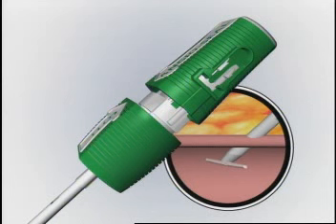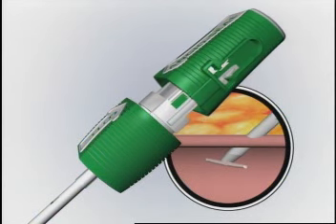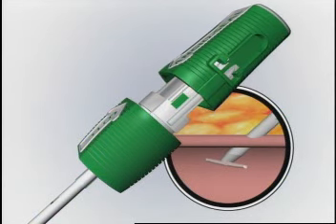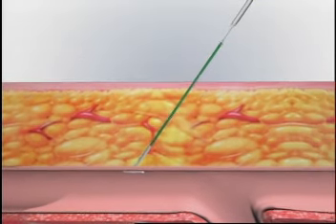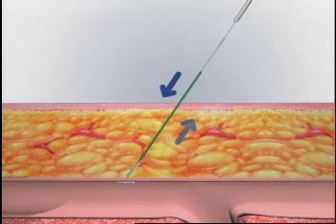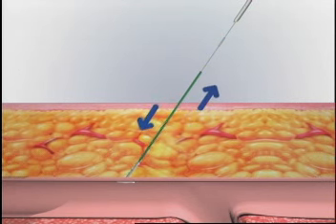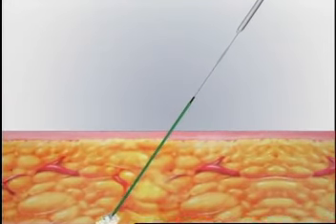You will now need to pull the device back into the final lock position. Some resistance will be felt as the device cap and sleeve lock together. The color bands on the side of the device should be fully exposed. Slowly remove the full assembly from the tissue tract until the tamper tube appears. Apply pressure downward while maintaining equal upward tension on the device hub in a gentle cinching motion. Continue to pull back until the suture has been deployed.